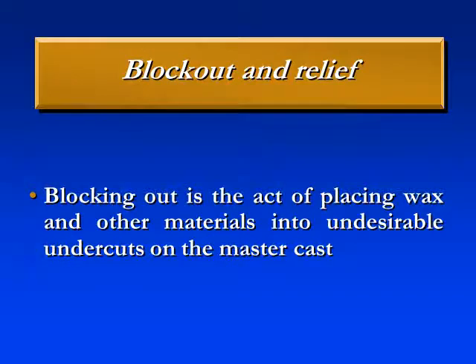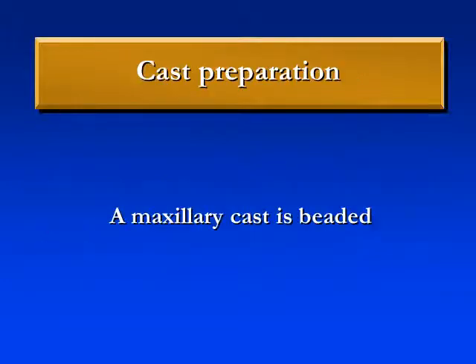First of all, we start with blockout and relief. By definition, blockout is the act of placing wax and other materials into undesirable undercuts on the master cast. We start first with cast preparation.